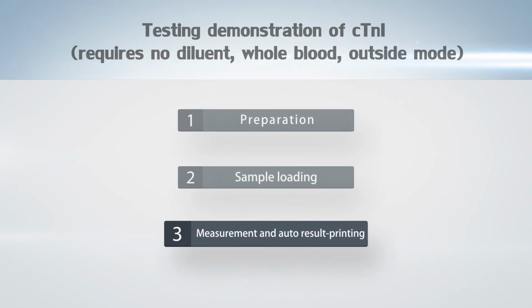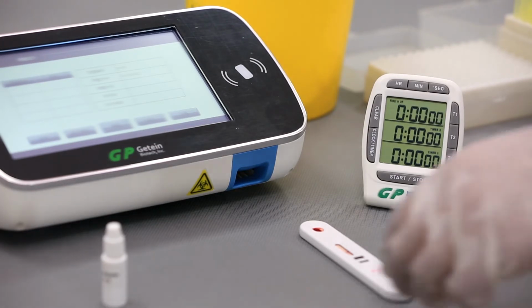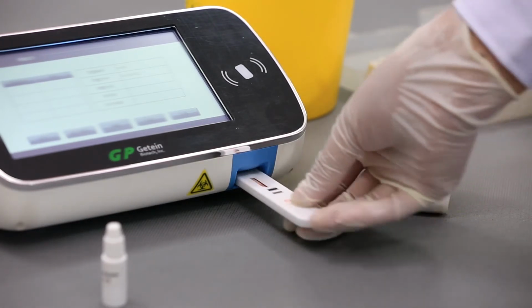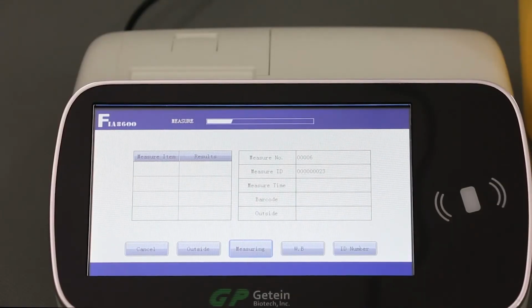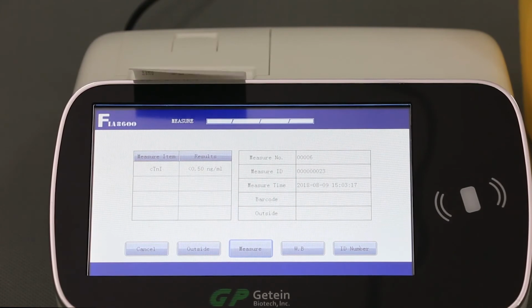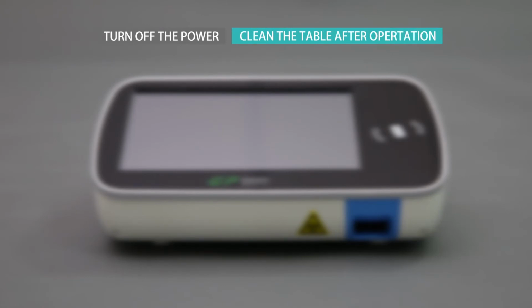Step 3. Measurement and auto results printing. After the reaction, insert the test card into the test port. Click Measure to test and print the results automatically. Turn off the power and clean the table after operation.